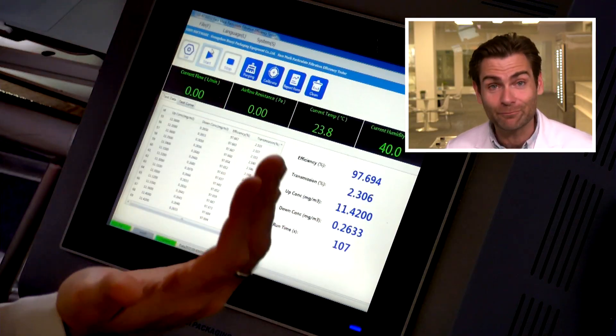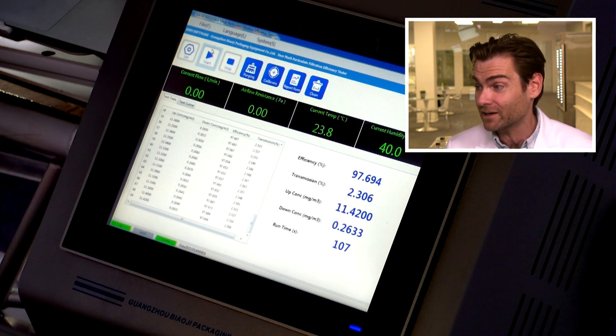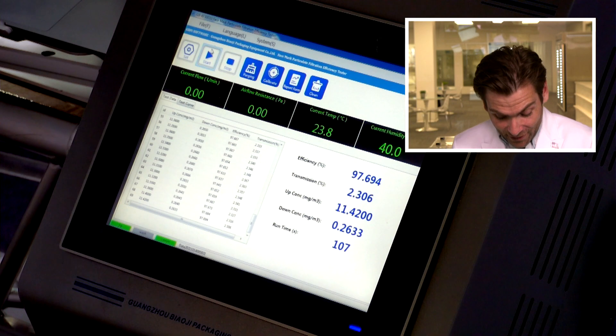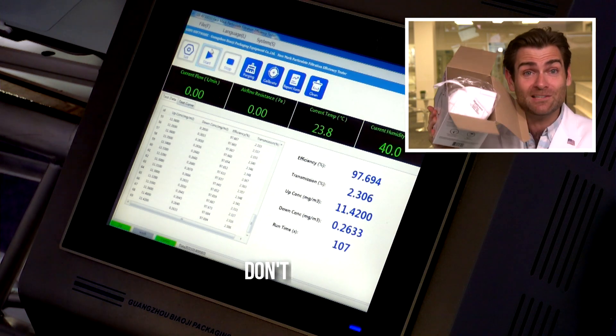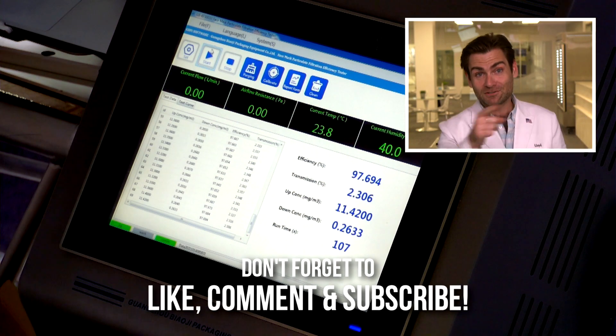It's 97% filtration — how good is that if you can't put it on your face for more than a second because it smells so bad? The mask is totally unusable. Honeywell, maybe seal the bag next time. That's it, I'm out — I'll catch you on the next test.